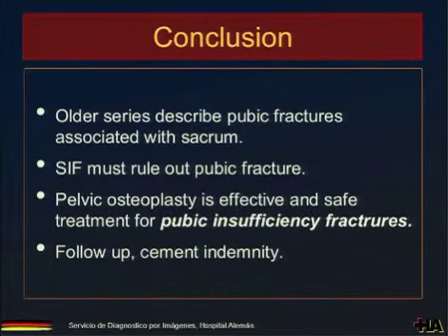This is a safe treatment, and we need follow-up to look for integrity of the cement, because we are talking about these shearing forces, and maybe we're going to need another kind of cement or devices.